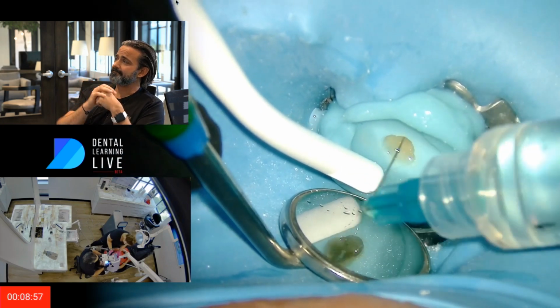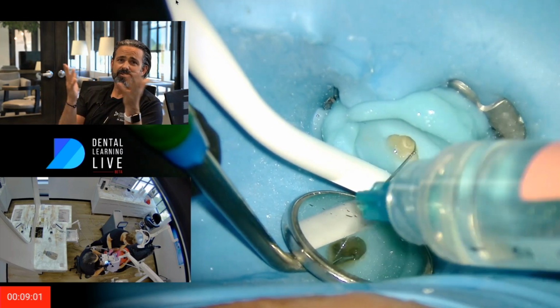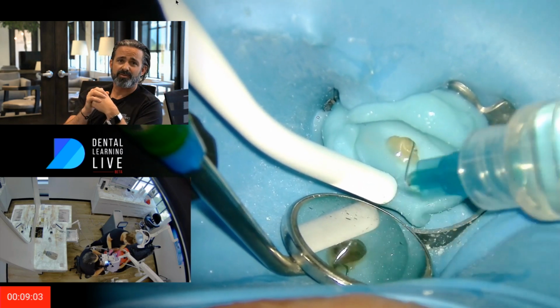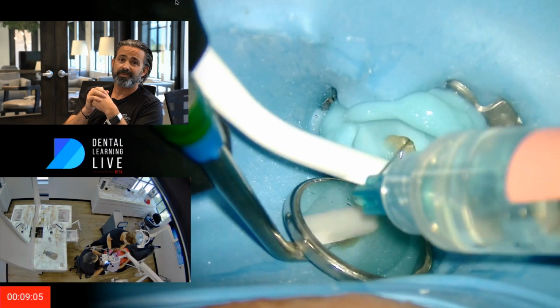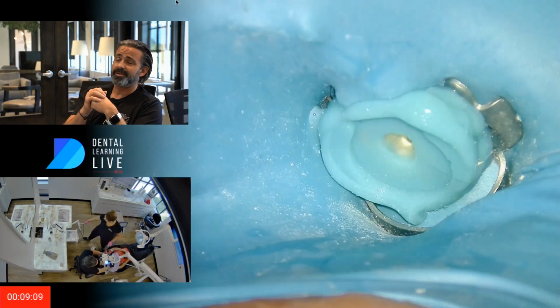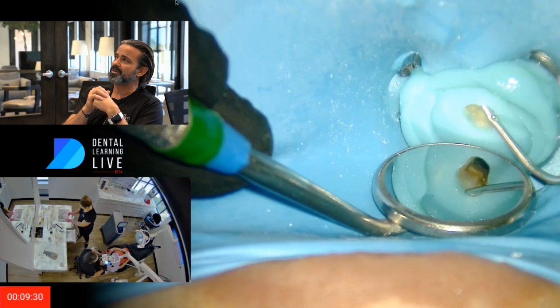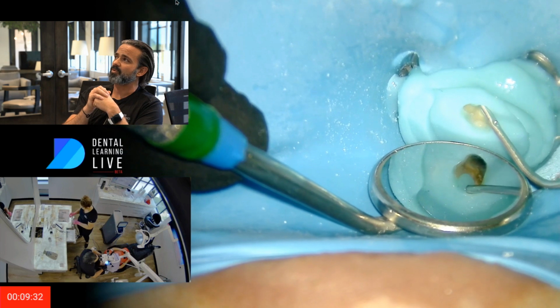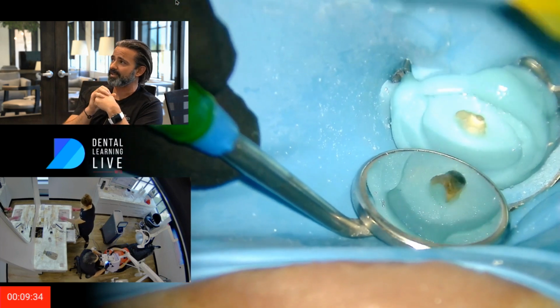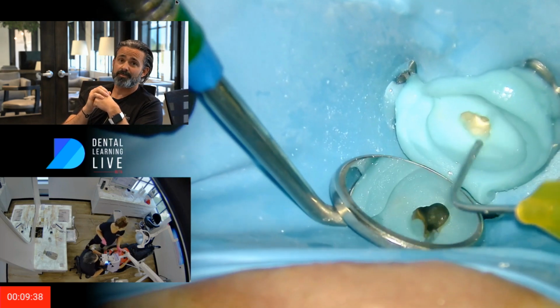And then I'm hand irrigating here because, after all, I create sawdust every time I use a mechanical instrument, rotary or file, like a burr or a file. So now I'm just flushing out the debris, and I'm going to really inspect that margin. And if you look at that distal lingual line angle or mesial lingual line angle, there's a little bubble there. I'm going to go the extra mile right now.